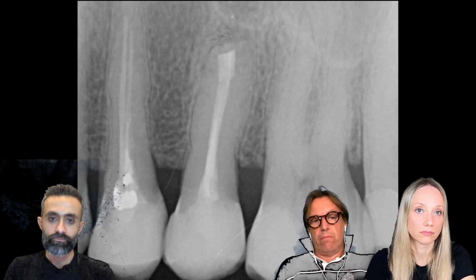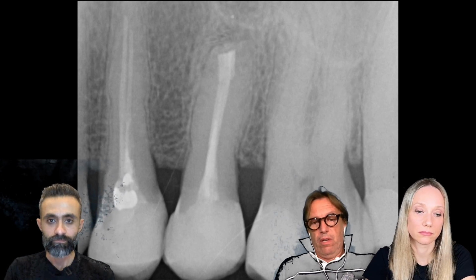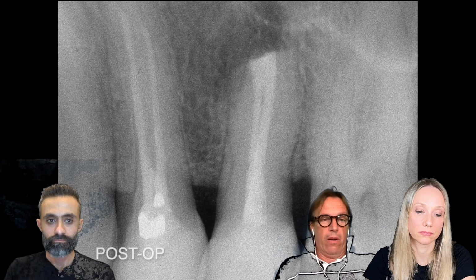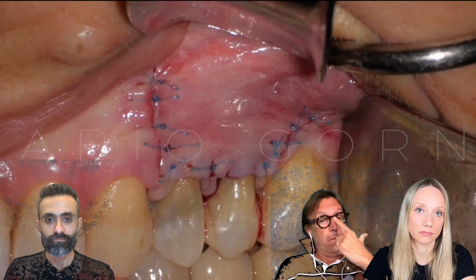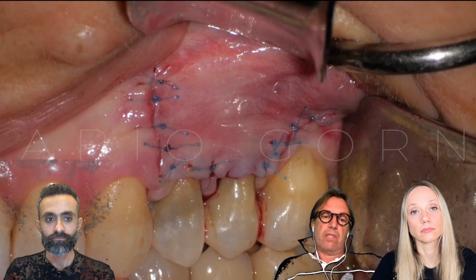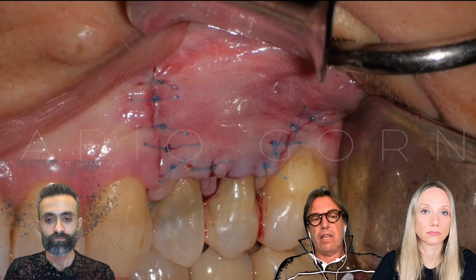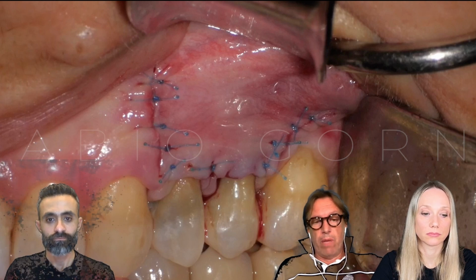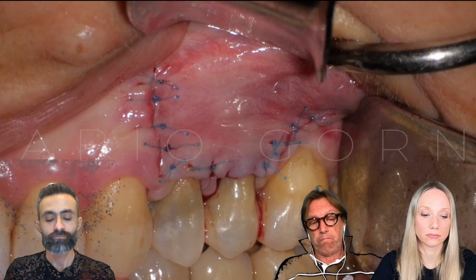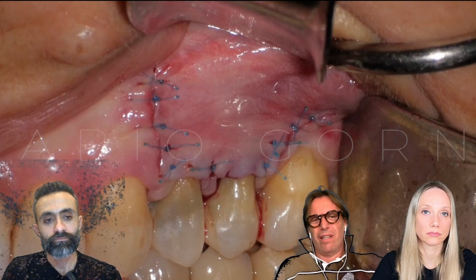Single stitches, you can use whatever you want in terms of material, nylon, resorbable sutures. Now, I prefer to use 6-0 resorbable suture, but it's not so important.